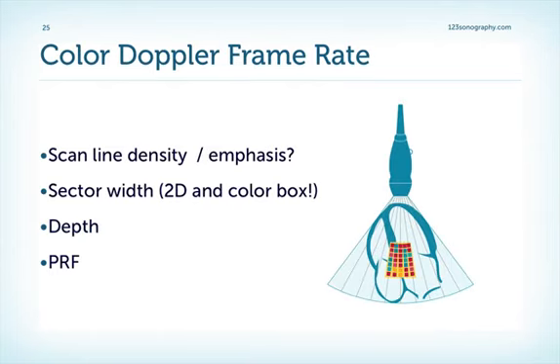Other factors that play a role for the frame rate of the color Doppler are the imaging depth and the pulse repetition frequency. But now it's time that we let Marion show us how we should adjust the settings if we perform color Doppler imaging.